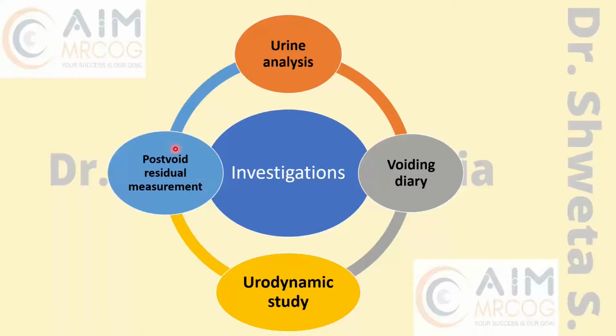This is important. Then if the woman has any voiding difficulties or she has recurrent urinary tract infection, then NICE recommend that you should measure post-void residual volume. So this is also an important aspect if the woman has any voiding difficulty. Then comes the urodynamic study. So there are certain indications to do urodynamics. You are not going to do urodynamics for all the women coming to you with lower urinary tract symptoms. So you have to understand the indication. You have to understand the prerequisites of urine analysis and voiding diary before doing the urodynamics.